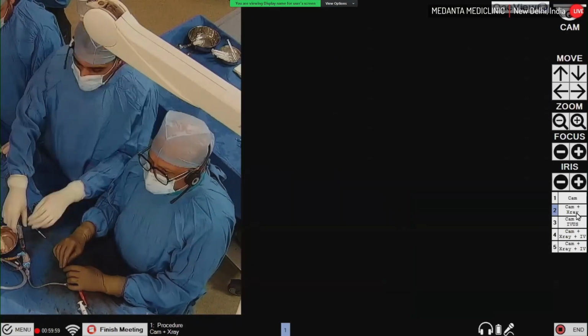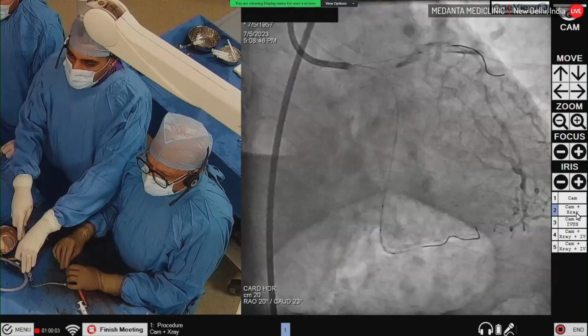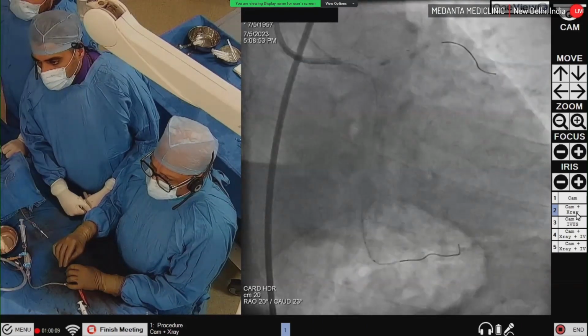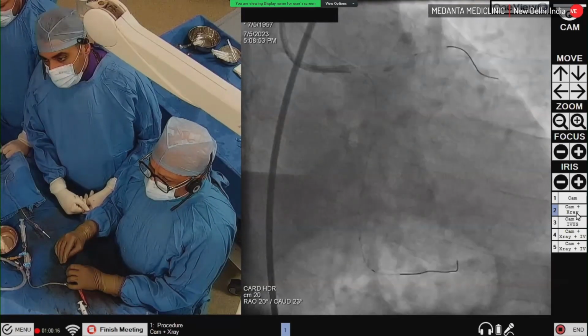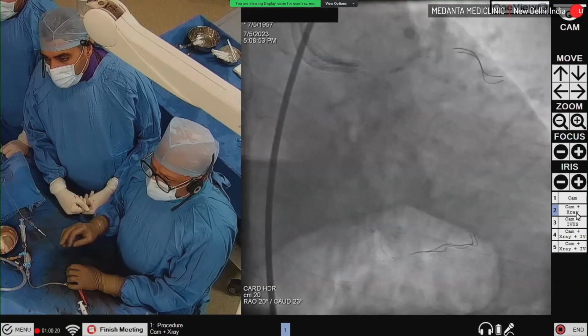Okay. Check, please. Yeah. So we have go up. Yes. 1, 2, 3, 4, 5, 6, 7, 8, 9, 10. Deflate. 1, 2, 3, 4, 5, 6, 7, 8, 9, 10.